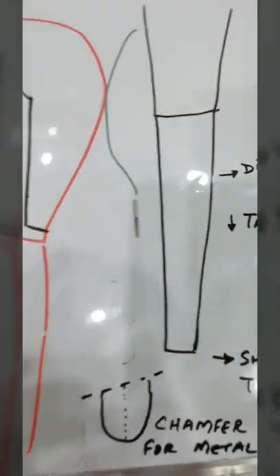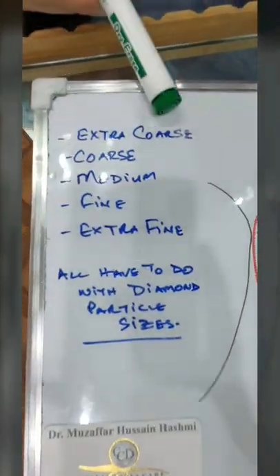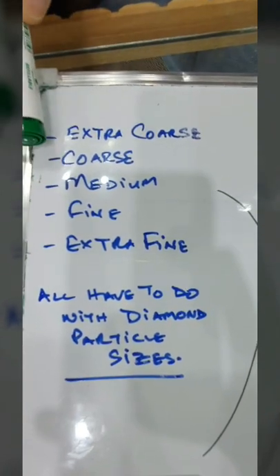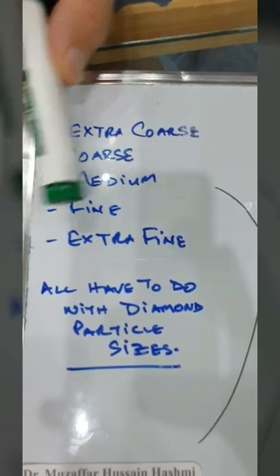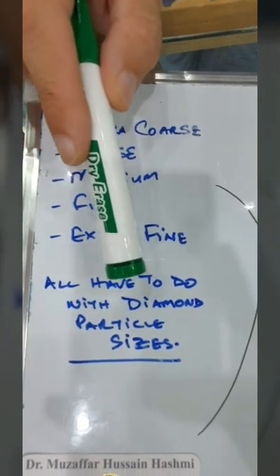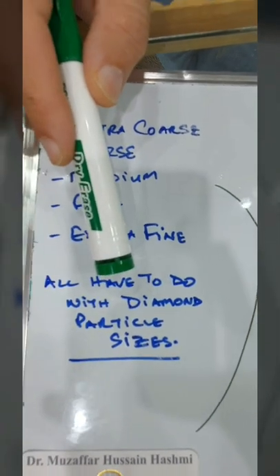Now if you come to this side, I have made a little list of what kind of burrs are available. You have extra coarse burrs, and they rapidly reduce the enamel or the tooth structure because they're extra coarse. Then you have a little less coarse, which are just called coarse. Then you have medium, fine, and extra fine. All of these have to do with the particle size of the diamond particles that are attached to the burr surface, and that is how the cutting happens.